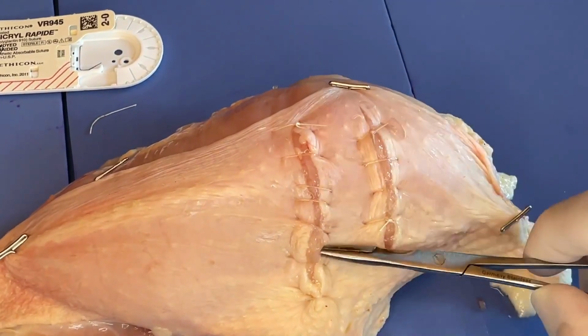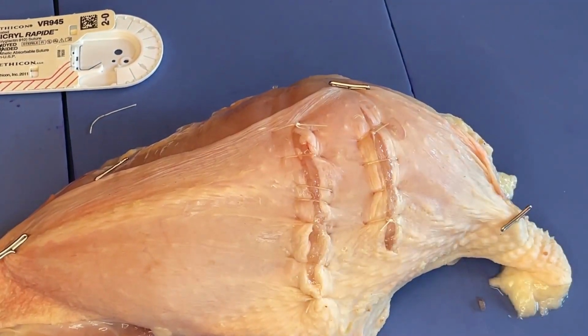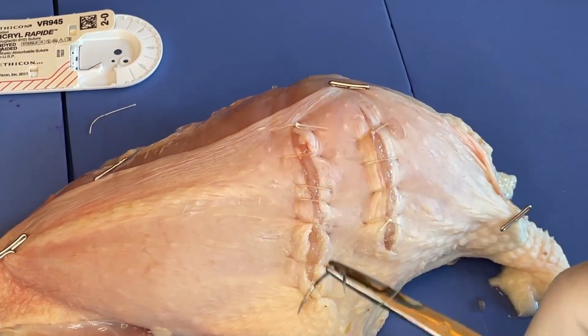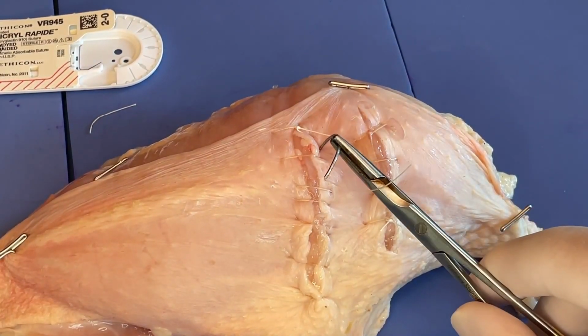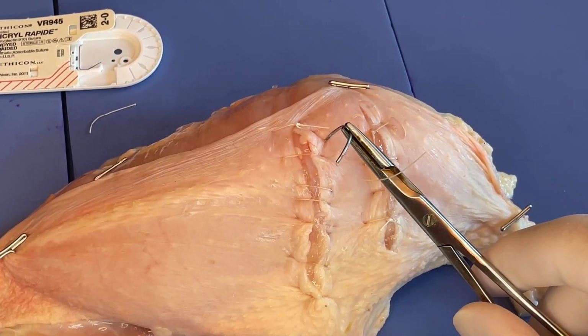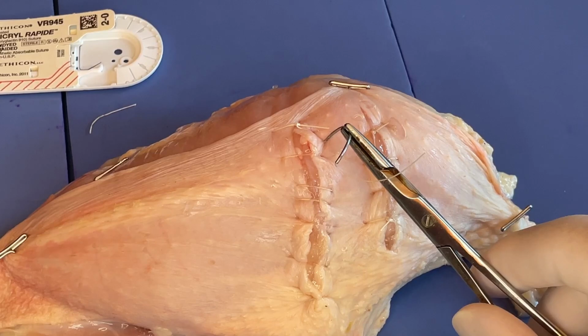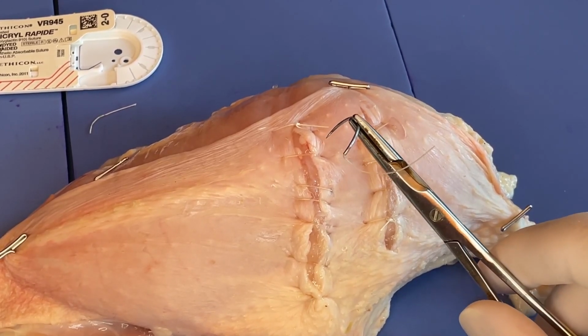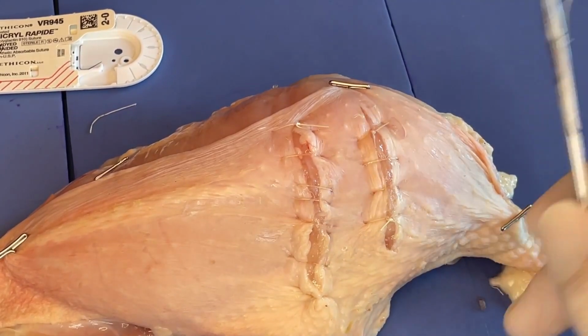So, running continuous suture, talked about the different depths that we get to. We want to make sure that we start and end beyond the apex of the defect, that we go full depth of the defect to get all of that divided tissue, areas of disrupted blood vessels, and sources of potential bleeding contained within the suture so that it's going to be compressed.